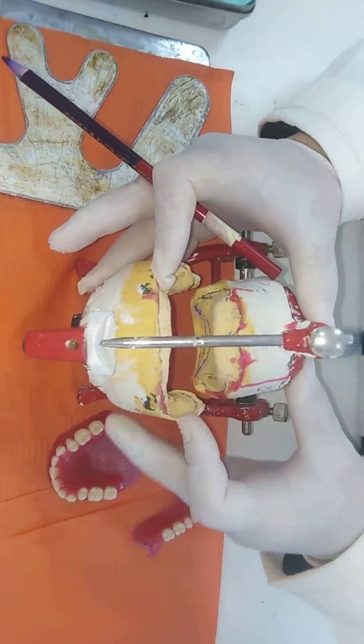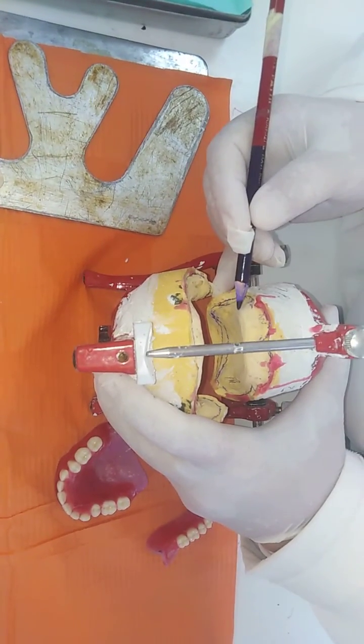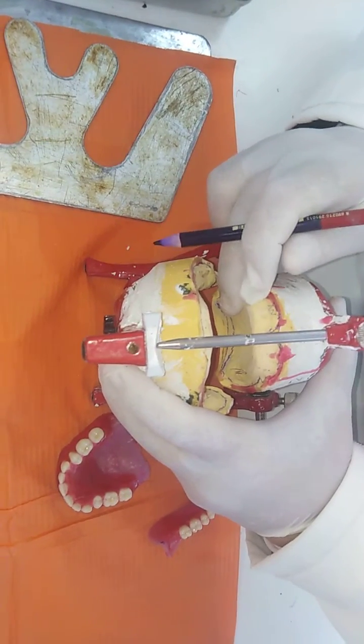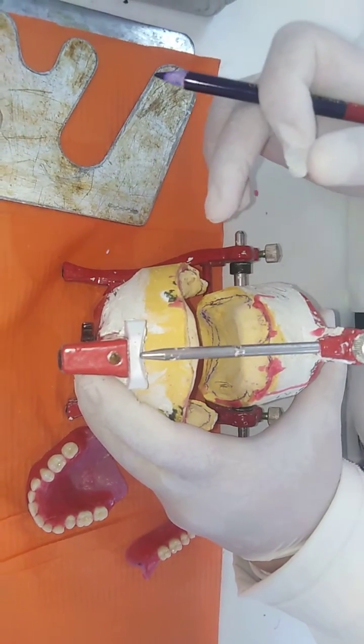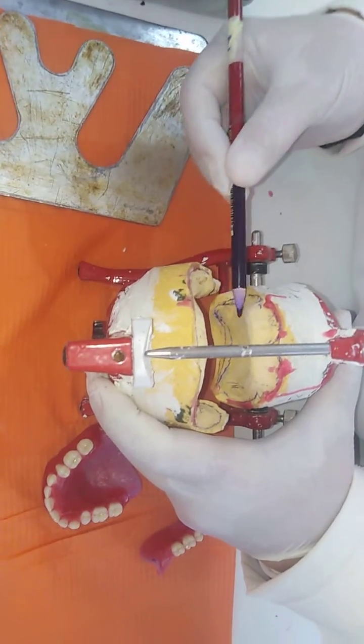Okay? If I want to follow this in setting, I'll have to set the molar teeth very far away from the ridge. The functional cusp will not be over the crest of the ridge. And what will happen is this denture will flex and even will be biting on the cheek. This is not practical.